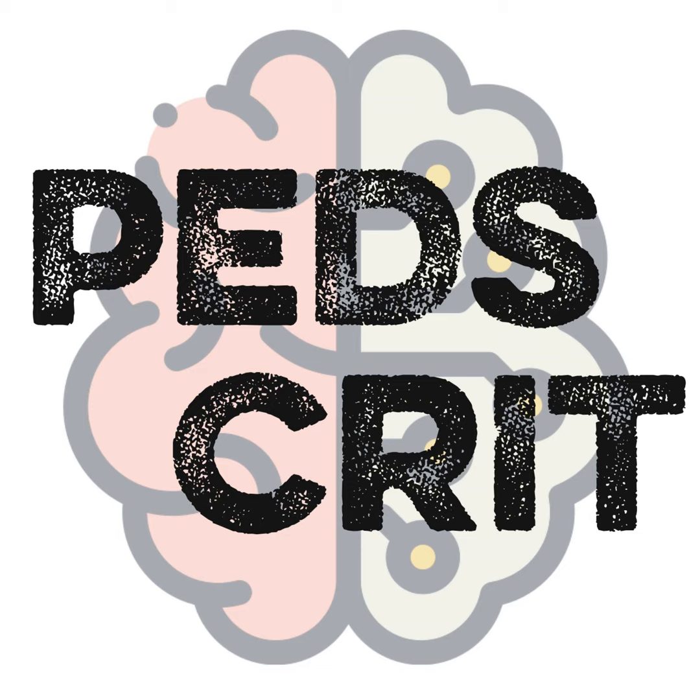Nice. And tell us, what is the main advantage of VAD over ECMO for these patients? The important morbidity that you acquire, right? One is bleeding from ECMO, but the other one is also the risk of stroke. And the oxygenator is the main culprit usually by the nature of it.